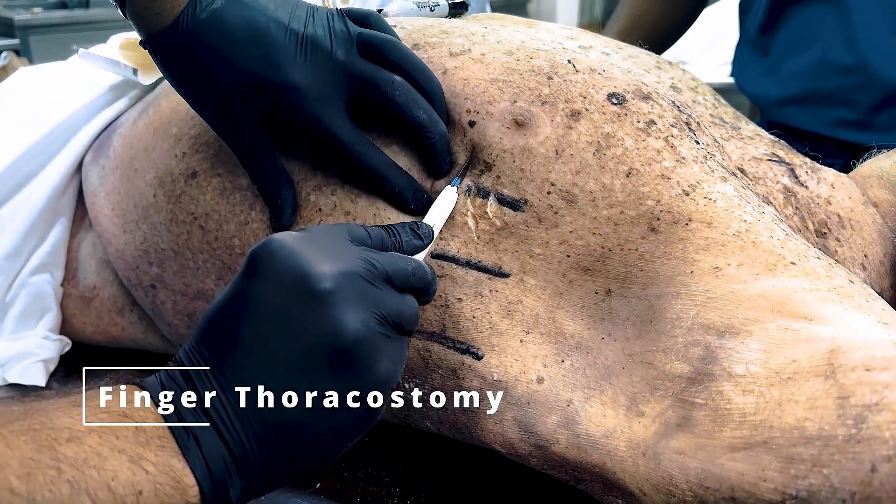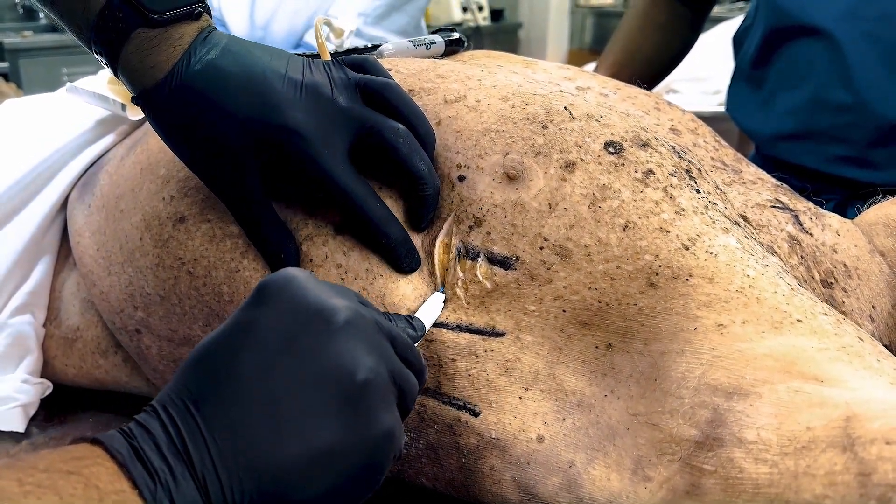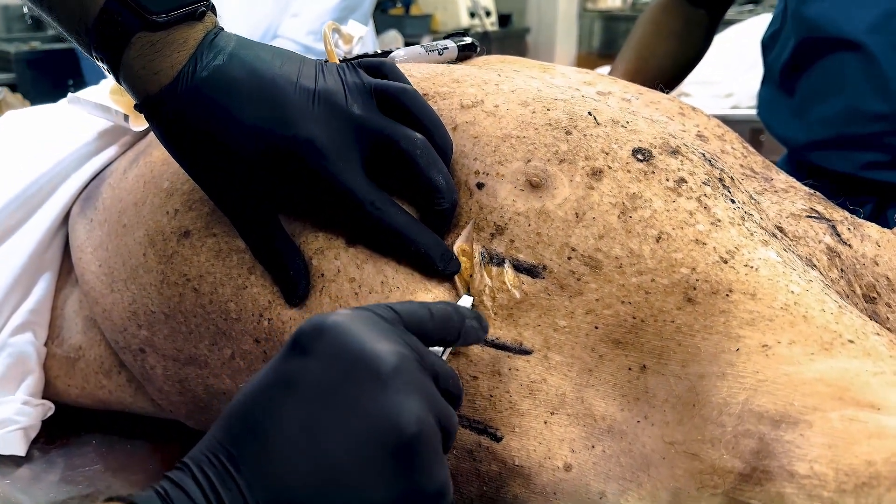Welcome to the instructional video on finger thoracostomy. In this demonstration we will go through the correct procedure for performing the finger thoracostomy in cases of traumatic cardiac arrest with suspected chest and or abdominal injury.